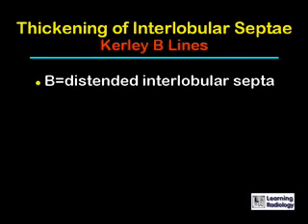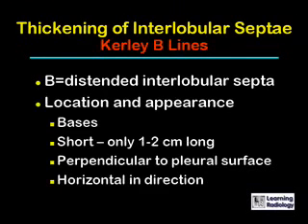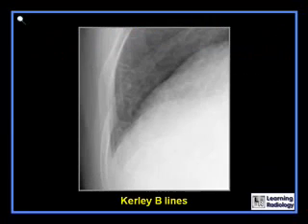Kerley B lines are distended interlobular septi. They are usually found at the bases. They are short lines, only about one or two centimeters in length. They are perpendicular to the pleural surface and they frequently touch the pleural surface; therefore, they're horizontal in direction. These are Kerley B lines — you see they are short white lines, perpendicular to the lateral chest wall and the pleural surface, and they are at the lung base.